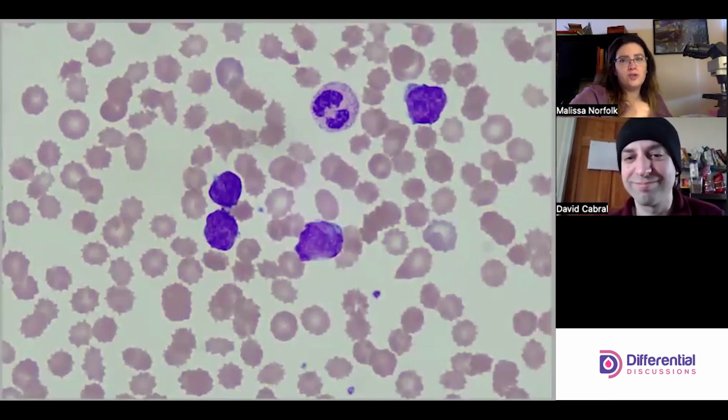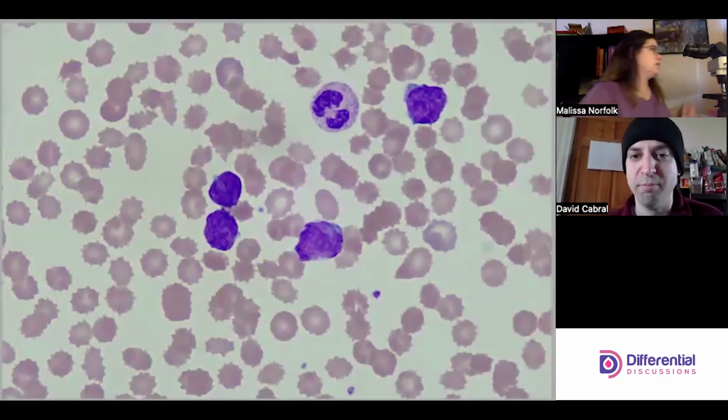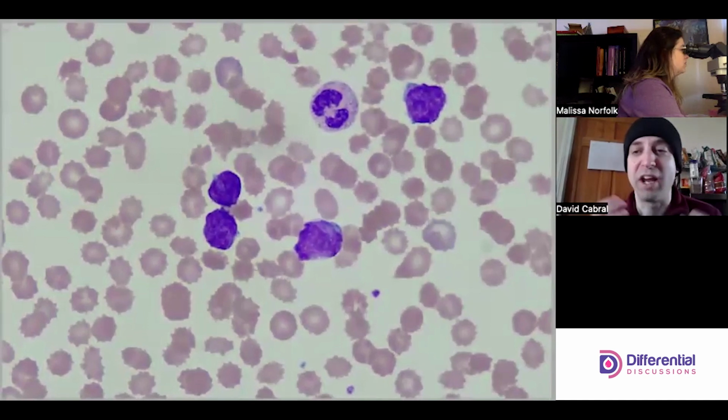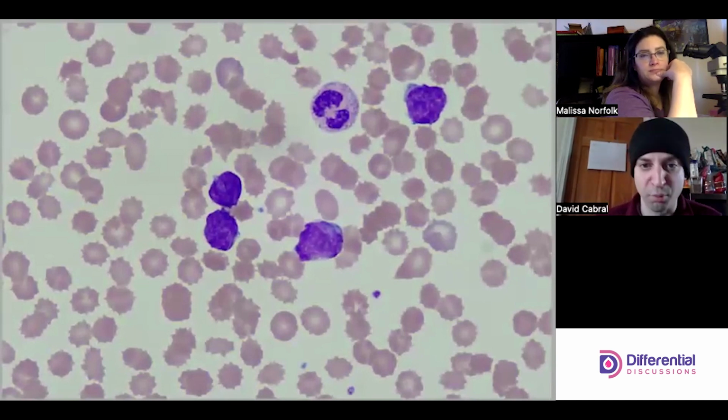They don't have super prominent nucleoli, but they're still abnormal, and they don't look reactive, because we'd be expecting more prominent angry changes in the nucleus, and we're just not seeing that. Really missing that basophilia that smacks you in the face. And if we look closely at the chromatin pattern, there are a lot of irregularities, a lot of weird shapes. That's a broad way to describe it.